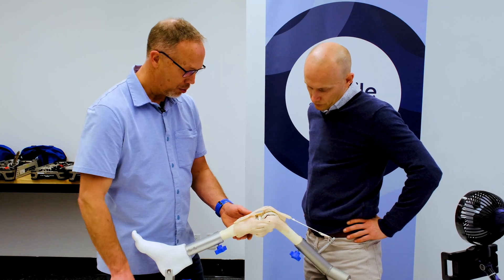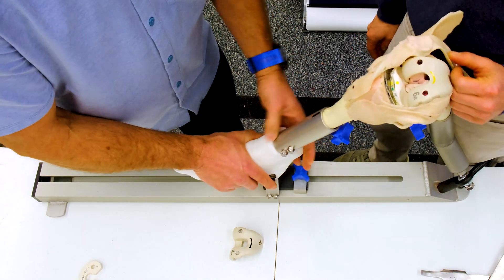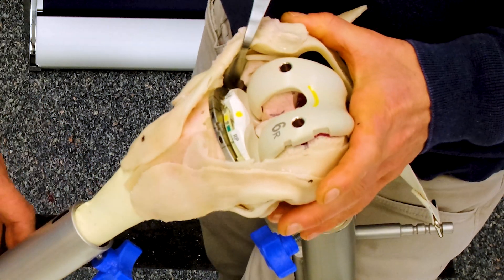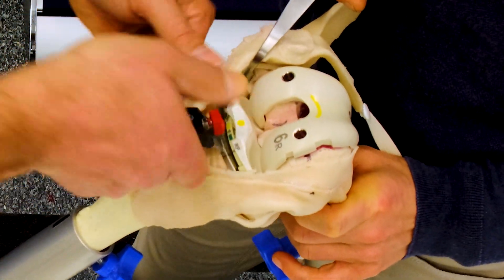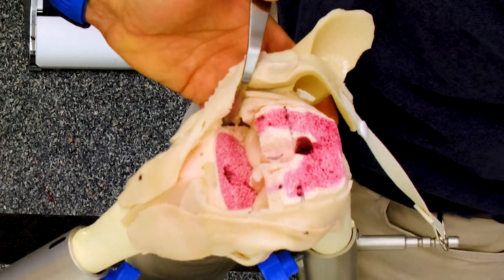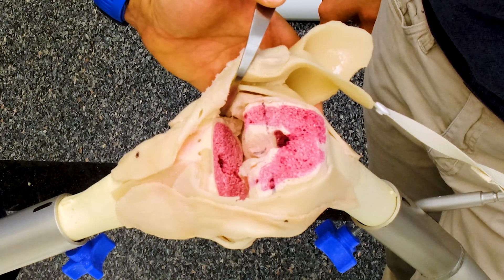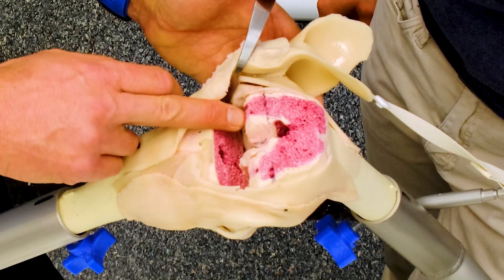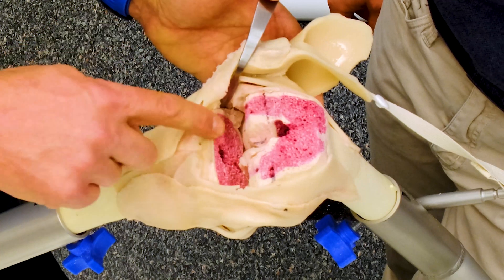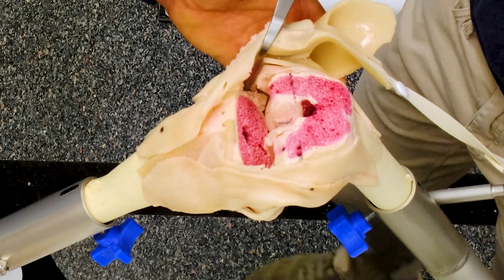Let's take this down and have a look at what we've done. Let's look at our flexion gap first — it looks fairly well balanced. We drew in our trans-epicondylar axis and our white-side line, though that's been taken off with our cuts. Our posterior cuts are parallel to our trans-epicondylar axis. So from a rotation point of view, the femoral component rotation looks good.